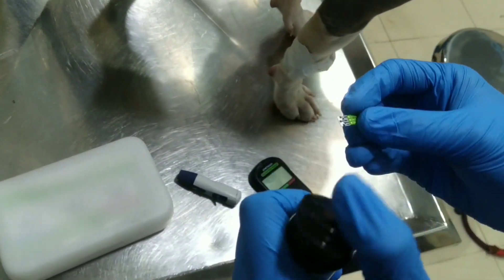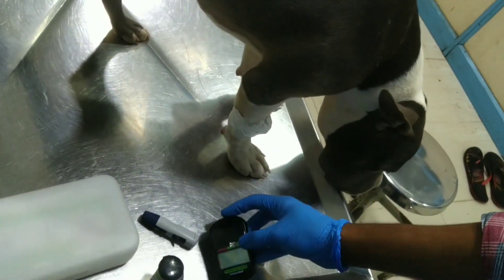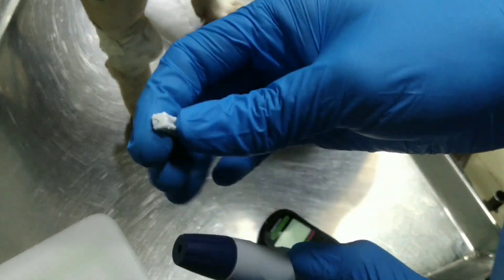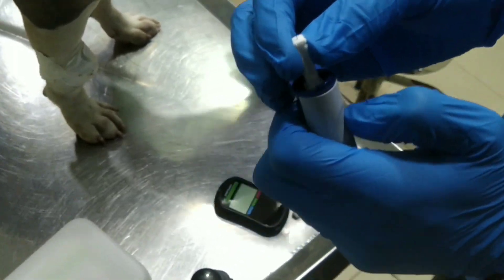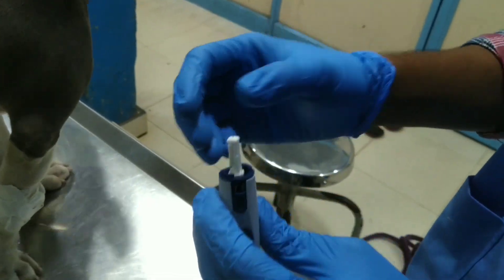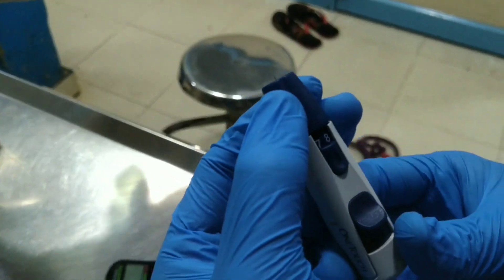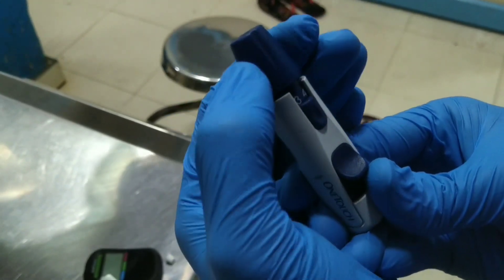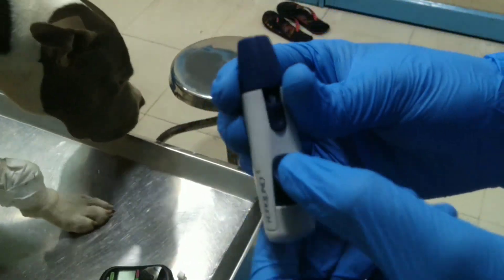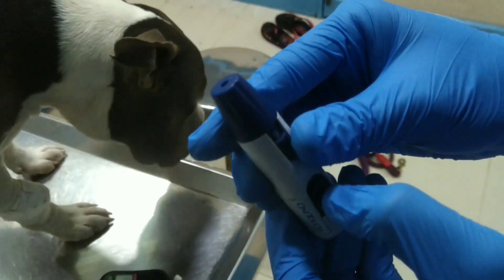Make everything ready. This is the lancet — remove the cap and insert it into the lancet holder. In the lancet holder, we can adjust the penetration power of the lancet by adjusting its depth. A lesser number means lower penetration, and a higher number like 9 means it will penetrate more. Load it and press the button.